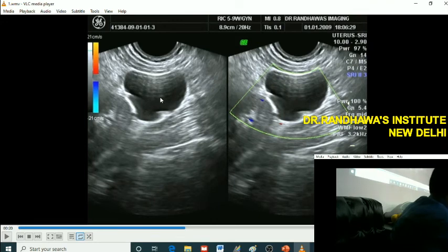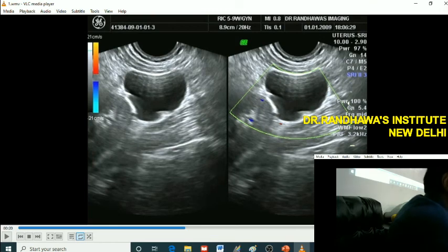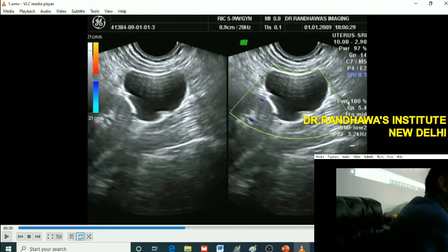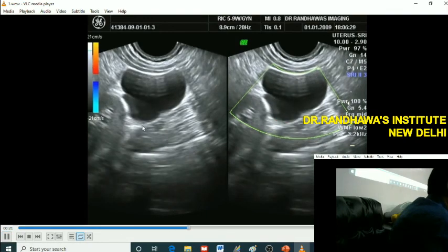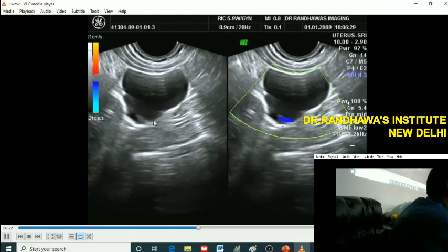Urine within the urinoma and urine within the ureter have different densities, so there is different acoustic impedance, and that is the reason the jets are coming. This black thing — what is the collection? Urinoma. This is all urinoma.